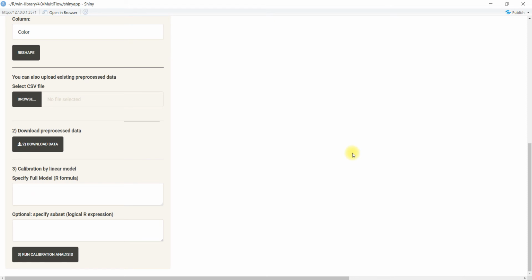Now let's say we want to calibrate the CRP, so we use mean2 green and take the relative values with respect to the sum of the two intensities. So mean2 is the test line and mean1 is the control line. Here you have to be careful that you have a valid R formula given here.